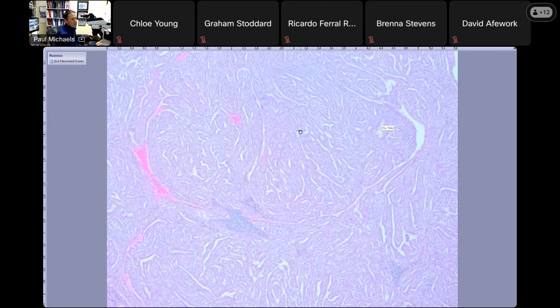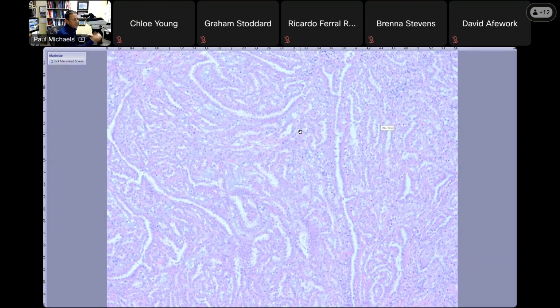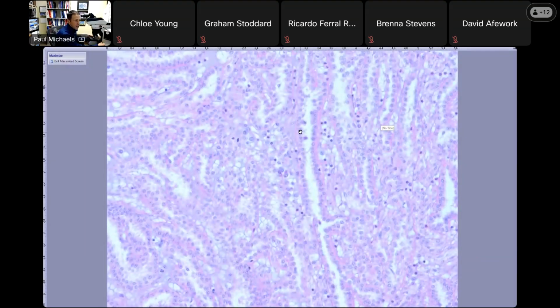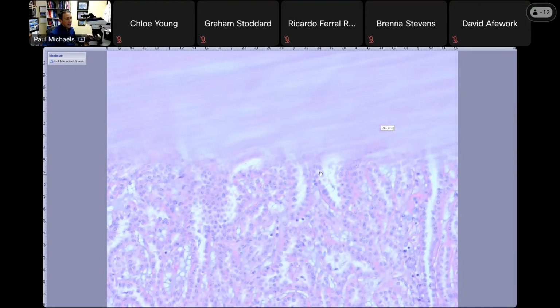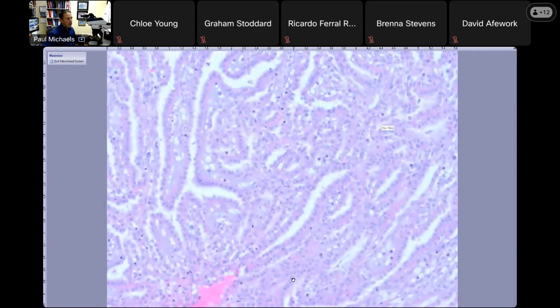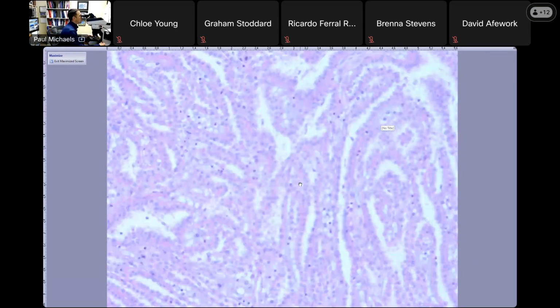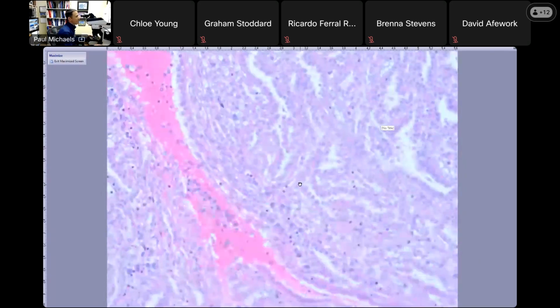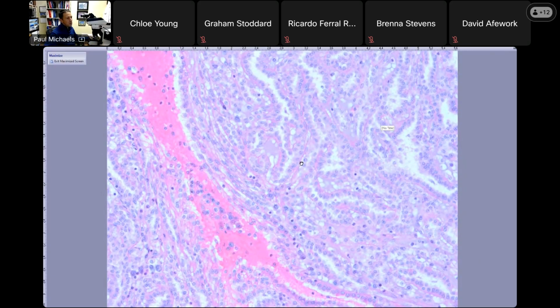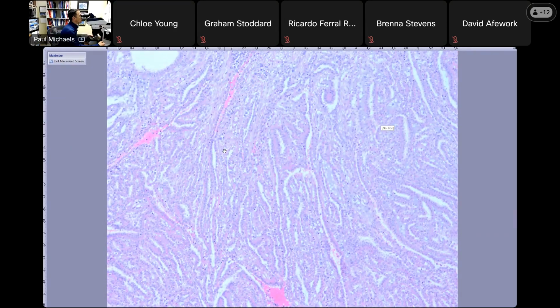Oh yeah, this is the other thing when you see tubules. So this is a relatively new, over the last 2 WHOs, I think, classification of a renal cell carcinoma that's usually well defined, has these long tubules, low cuboidal cells that are very bland, and then you'll see that kind of myxoid mucinous stroma. Here's some more of that bluish stroma, and then you'll have areas where it kind of transitions into slightly more spindled areas. Again, long and anastomosing tubules, low cuboidal cells, bland morphology. This is a mucinous tubular and spindle cell carcinoma of the kidney.